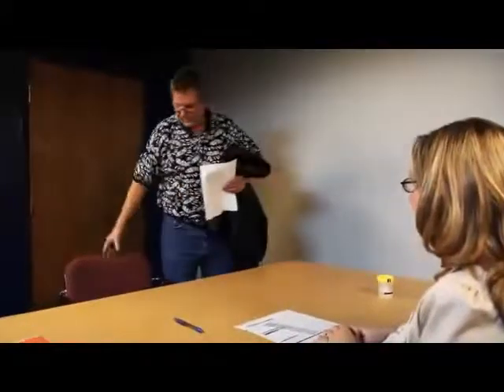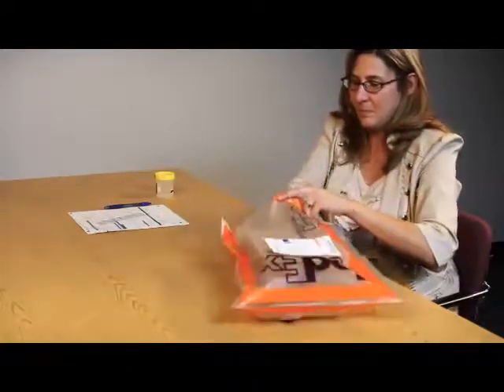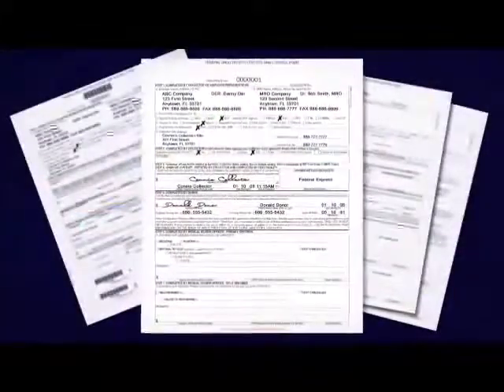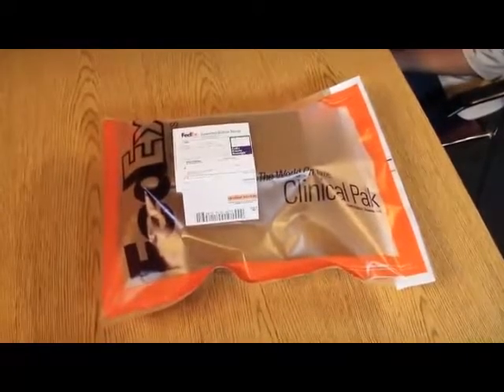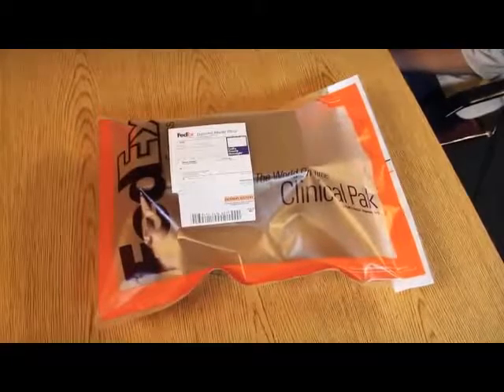Any urine specimen left over in the collection container after both specimen bottles have been appropriately filled and sealed must be discarded. Place the sealed plastic bag in an appropriate shipping container designed to minimize the possibility of damage during shipment. Seal the shipping container as appropriate. Send copy 2 of the CCF to the MRO and copy 4 to the DER or service agent if authorized by the employer. The collector or collection site must ensure that each specimen collected is shipped to a laboratory as quickly as possible, but in any case within 24 hours or during the next business day.